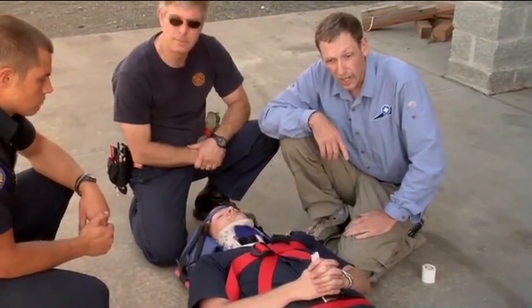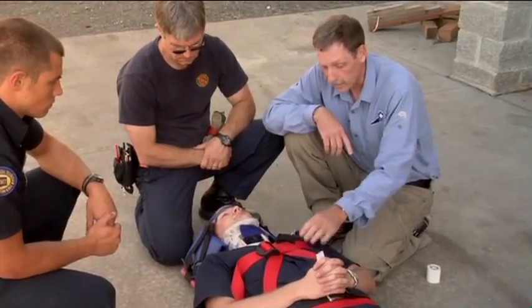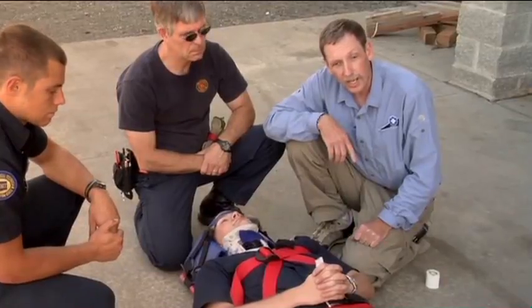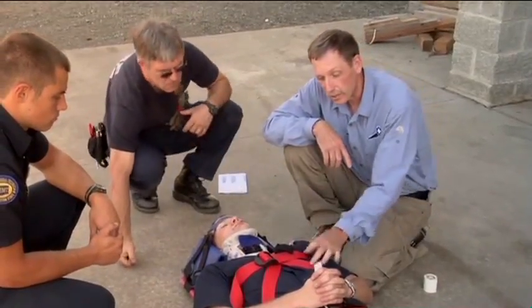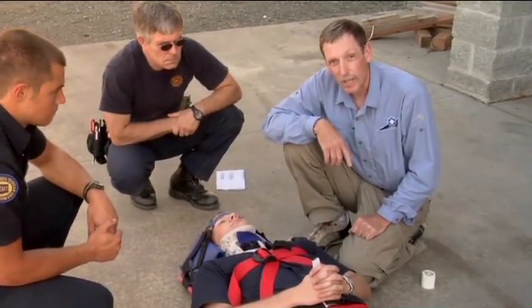And in a technical environment, we would recommend to use this instead of a harness and use the backboard as the harness. But certainly in any sort of rough terrain, over-the-edge type of rescue, this is what EMTs and paramedics ought to be shooting for, just because of the strap-to-patient contact.